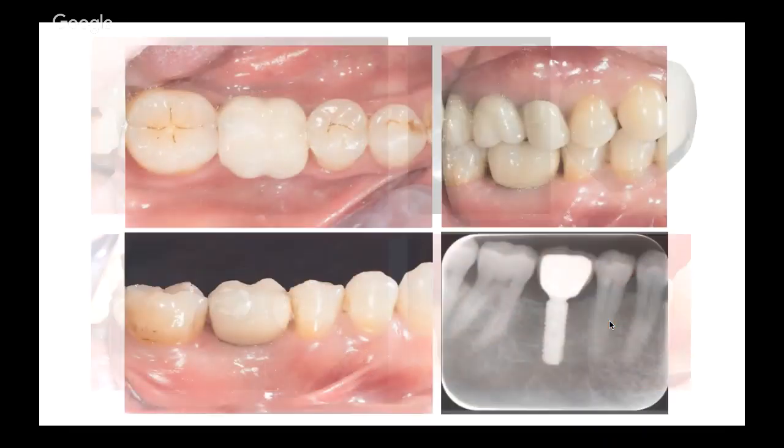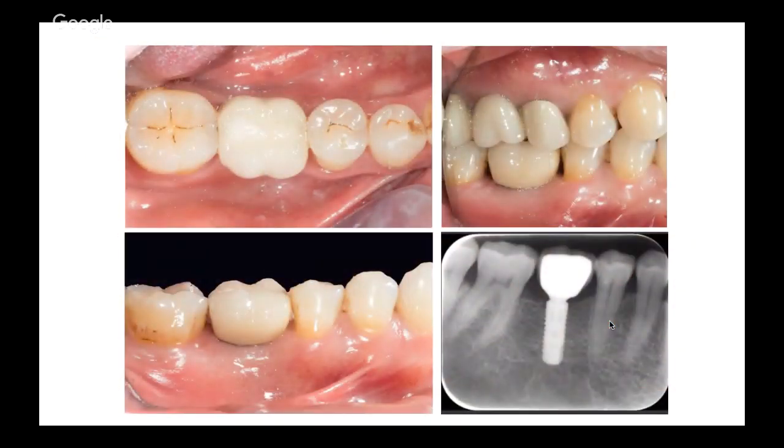In my point of view, it didn't succeed. I didn't like it so much. The thing I didn't like was that there are no interdental papillae. This was not my intended outcome. I wanted a crown with a beautiful emergence profile.